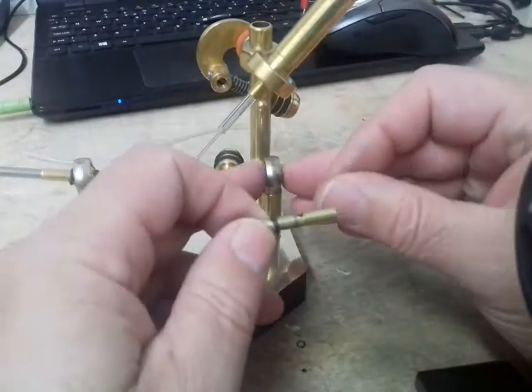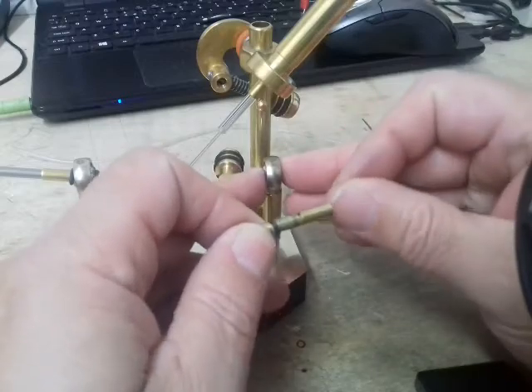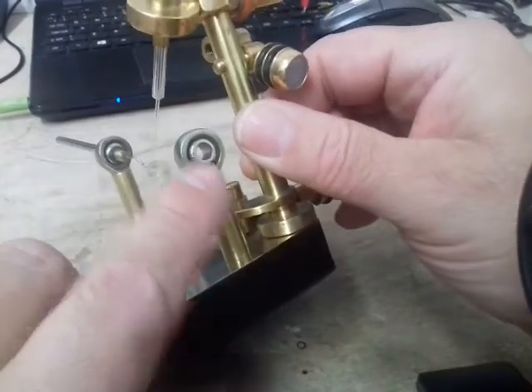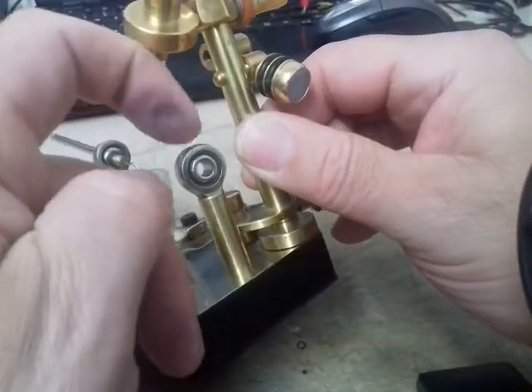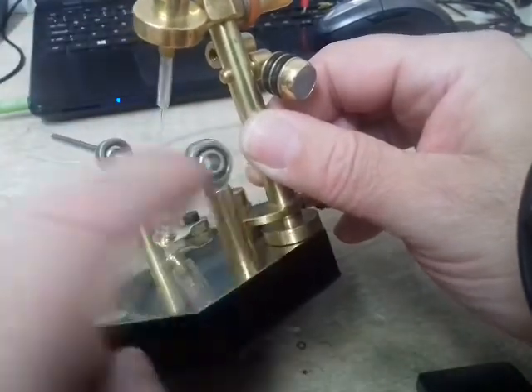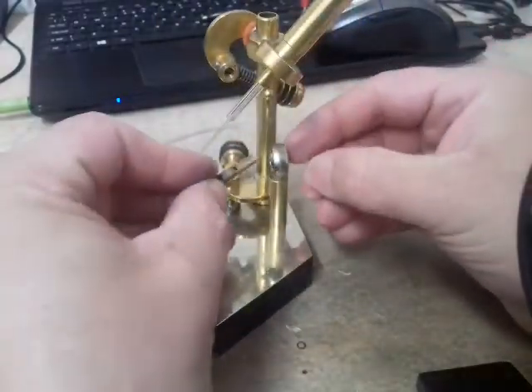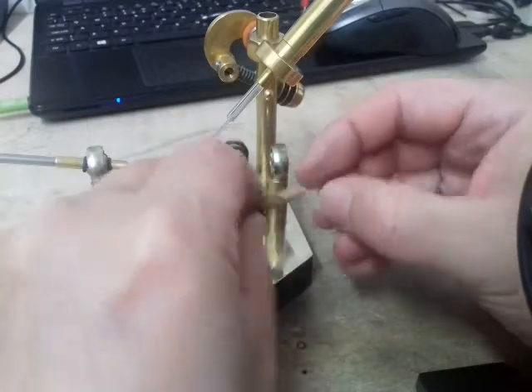So with that out there, you can see what I mentioned earlier. Just turn that ball so it's facing upwards. Then you can drill down through the middle of there without marring the smooth surface. So I'll put all that back together, and that's it.